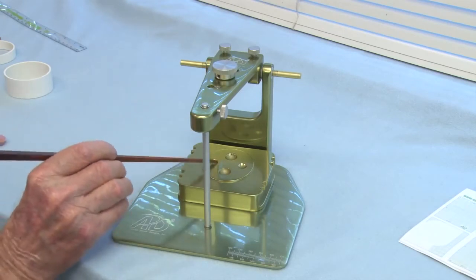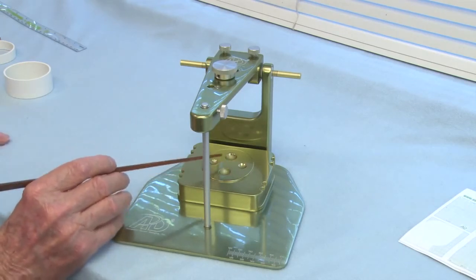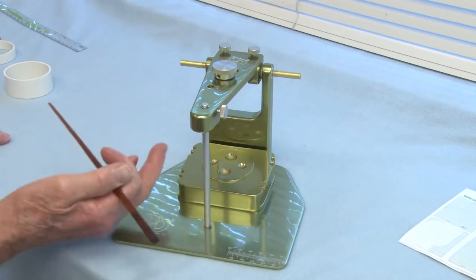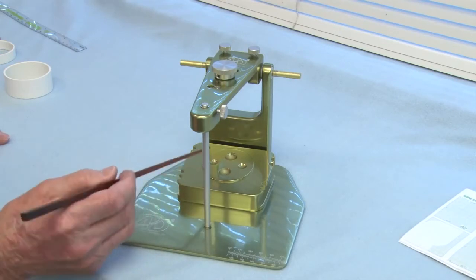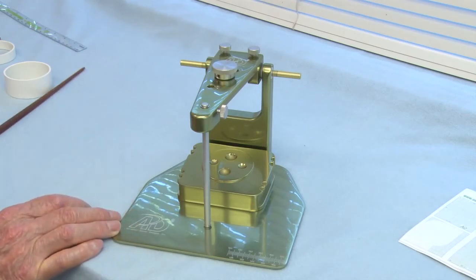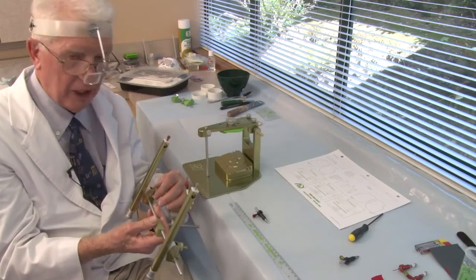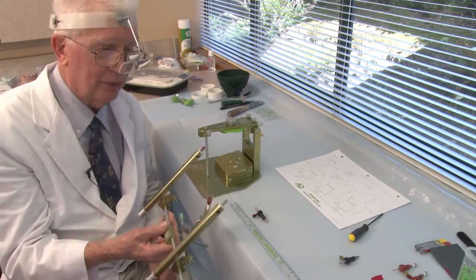These holes are references so that if you don't have time to mount the model now, you can take the bite fork off with the plaster, and you can bring it back at a later date, and it sets right in that exact spot, and then you can mount your upper model. And that's basically how the hinge axis mounting stand is used. The patient has been dismissed. Now then we have to do our lab procedures.